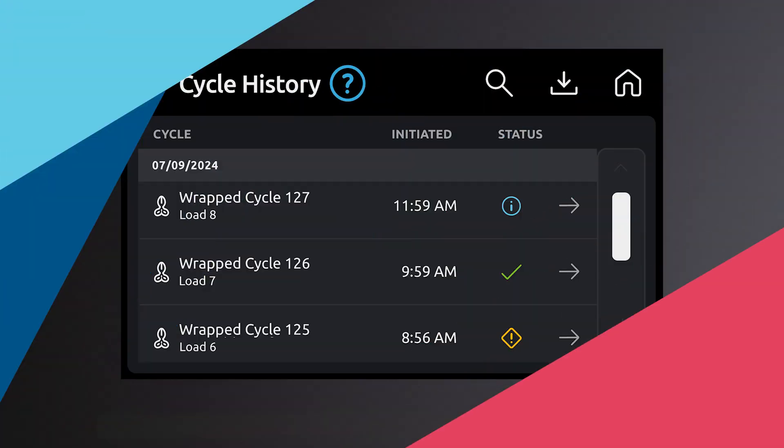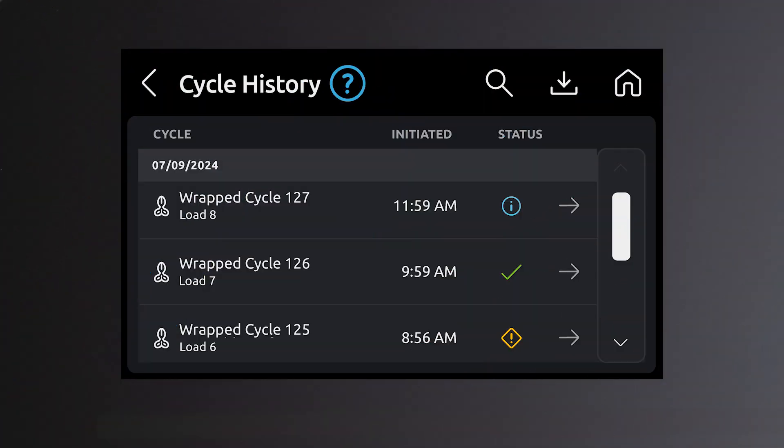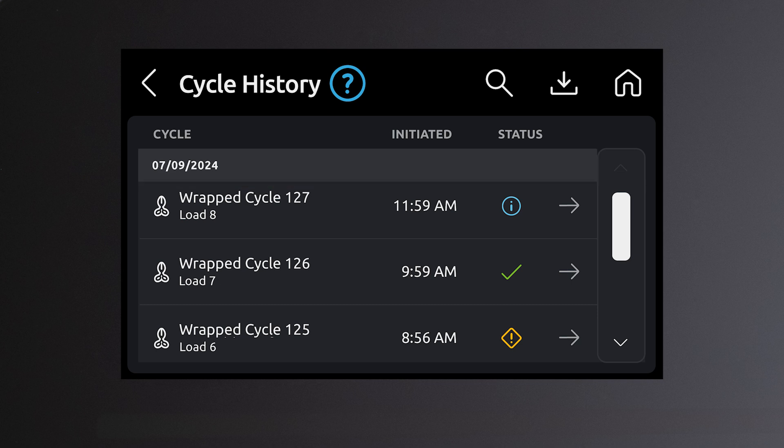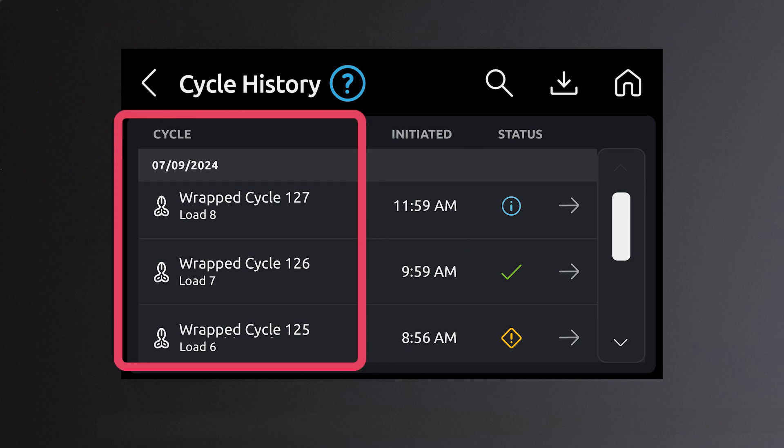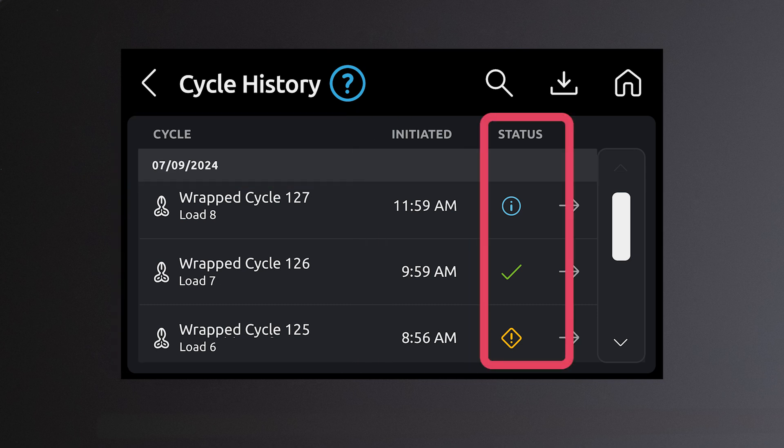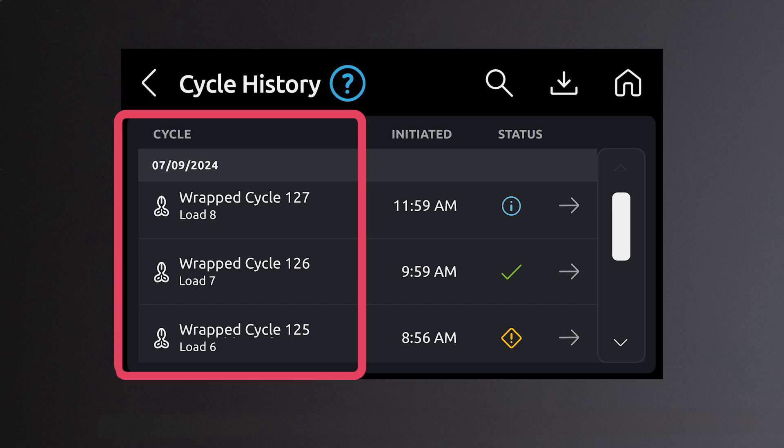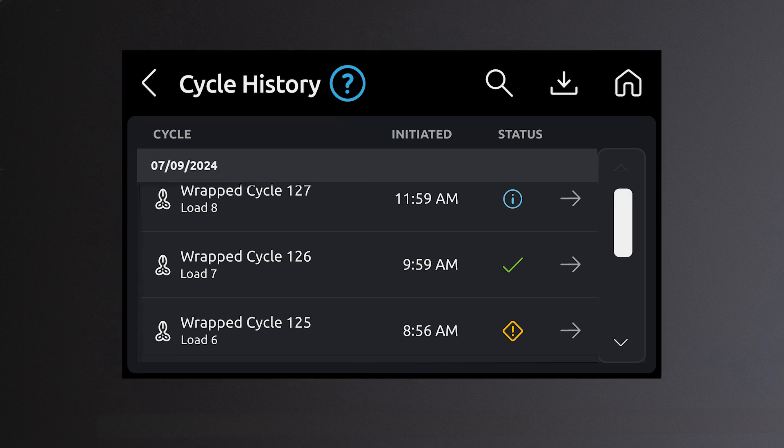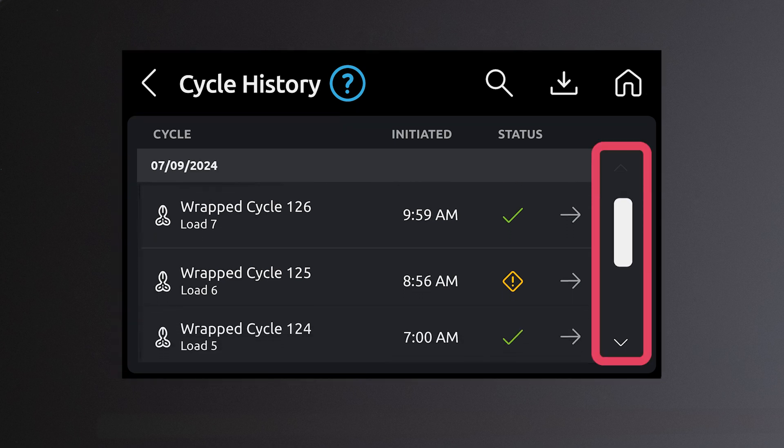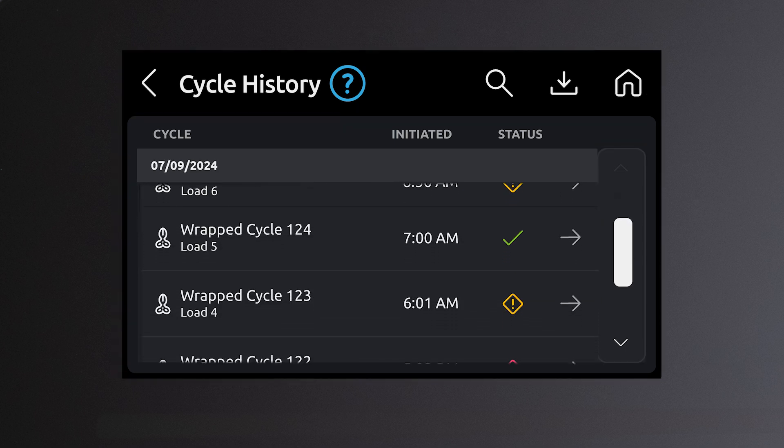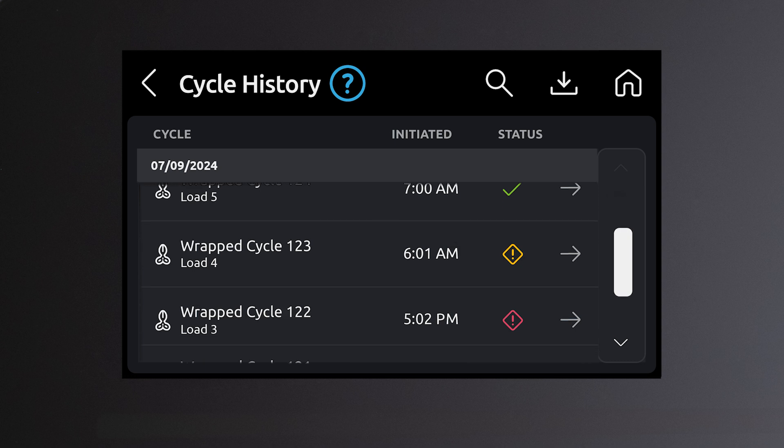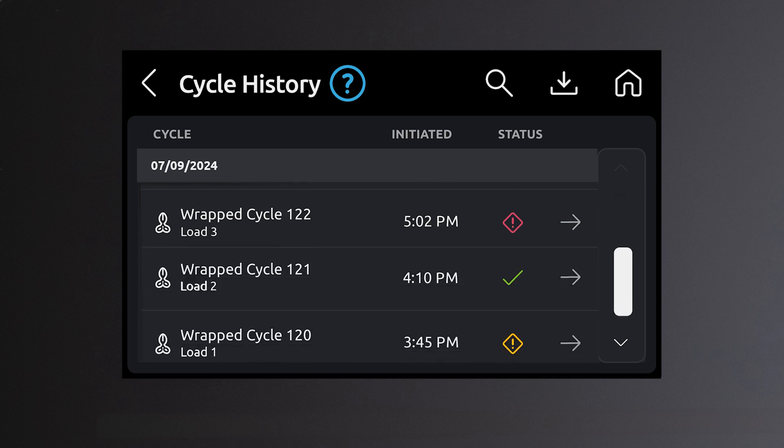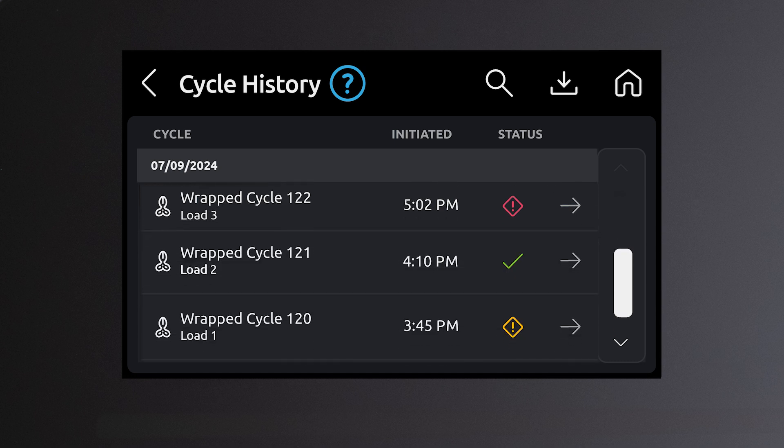The cycle history screen allows you to view the cycle history including date, time, cycle type, status, and cycle number. The scroll bar on the right of the screen allows you to scroll through cycle history information and view cycle status.